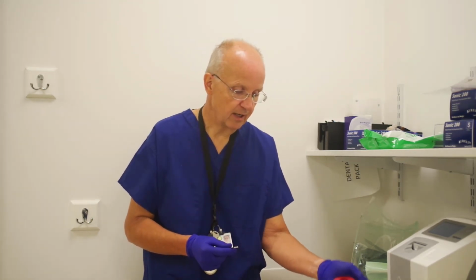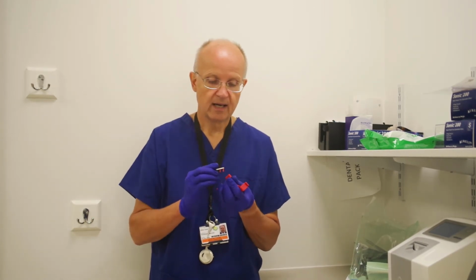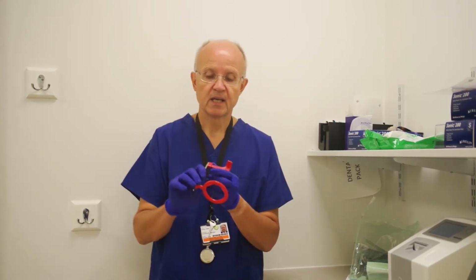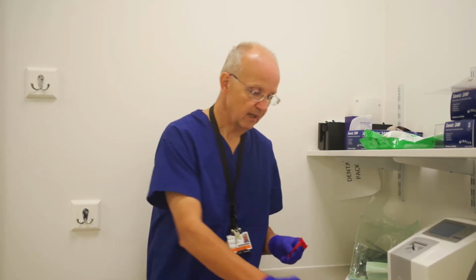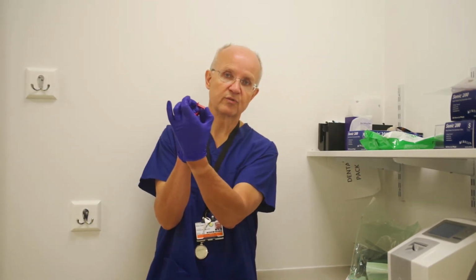Okay, so again we have three parts to this holder. We have the bite guide there that's going to hold the film. We have the bar forming the beam aim device with the ring. Now, when we place these into the mouth, they are very slightly different because the film is going to be held in these grooves here.